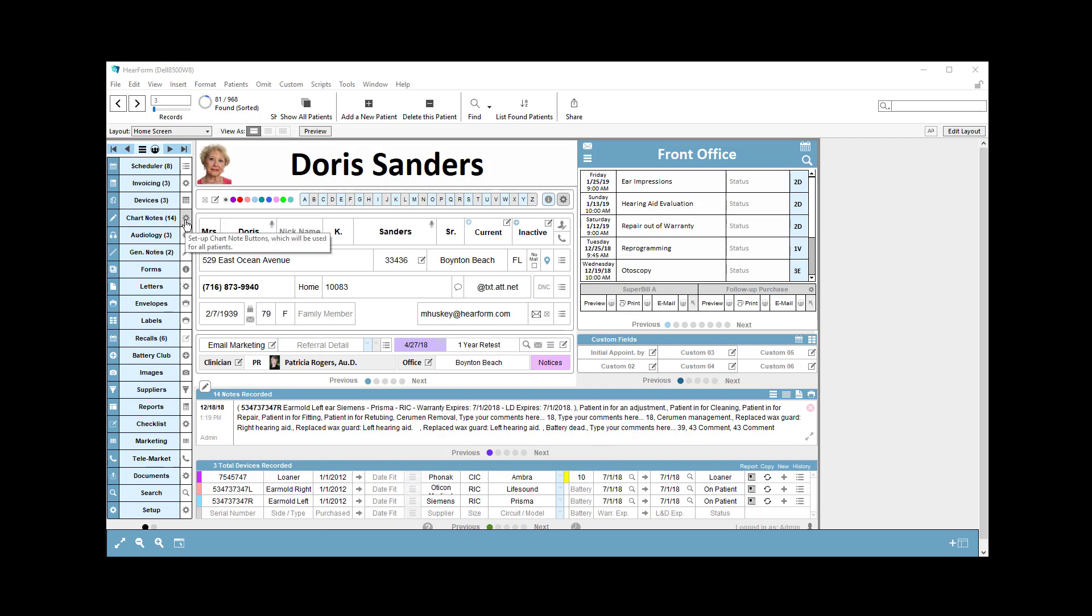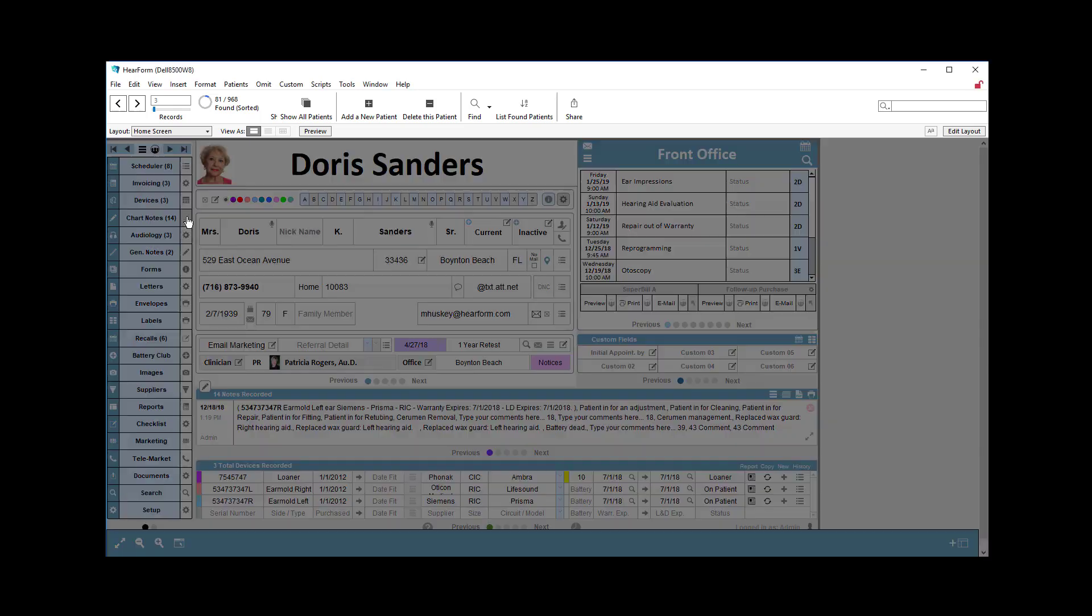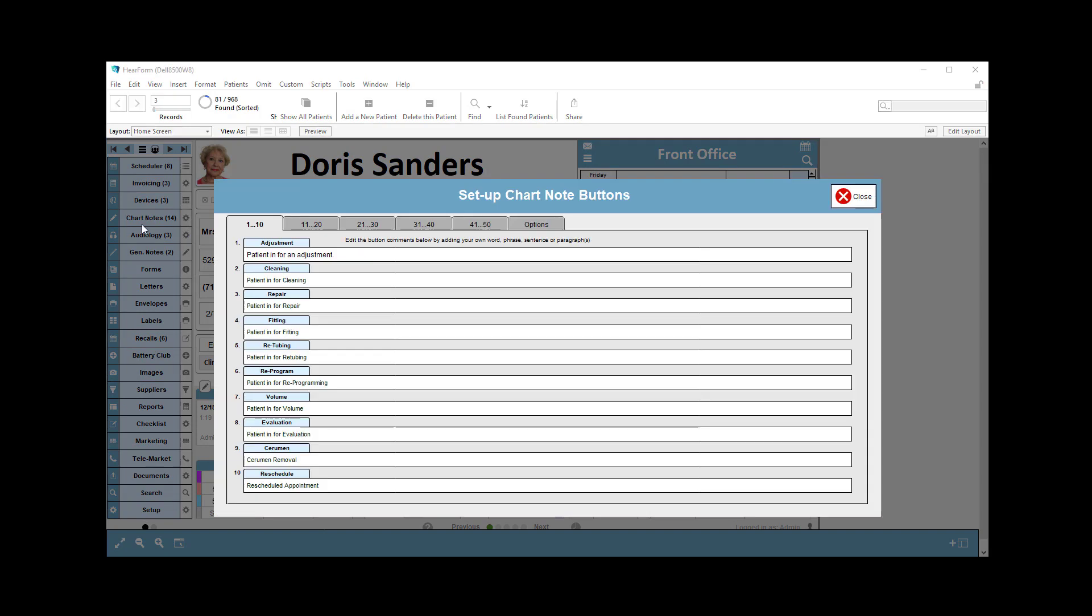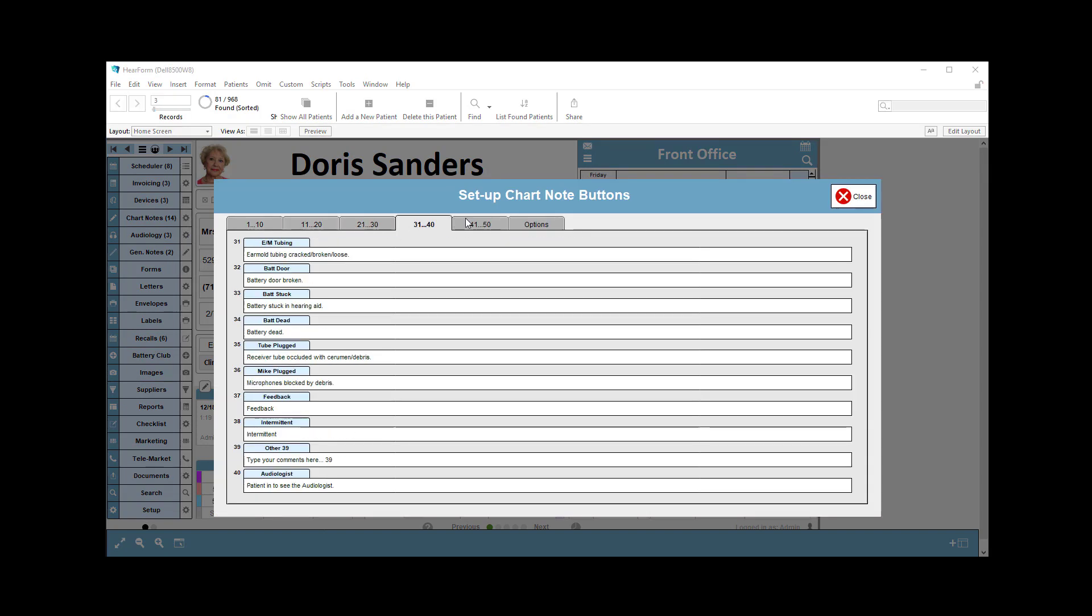From the home screen, click the gear icon to the right of the chart notes button area. That takes you to an area where you have several tabs here, and I'm going to give you an example of how you would set those up.